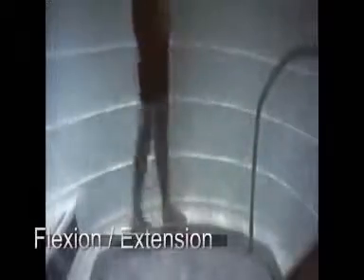First thing I would do for an athlete to get to use the HydroWorx, which is usually the first thing I have them do when they come into the training room, is to have them come in and work on the range of motion. But first you've got to get them warmed up, so I have them walking a little bit just to get warmed up, get comfortable, and then just going through a comfortable range of motion. That is not stressed very much, to make sure that everything is pain-free range of motion. And once they're in there for 10 to 15 minutes, usually the range of motion increases quite a bit, and that's the idea behind it.